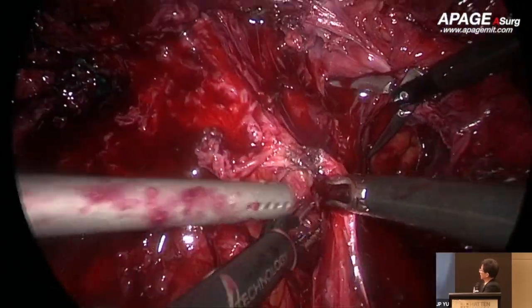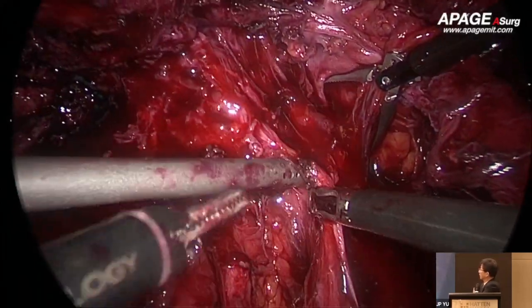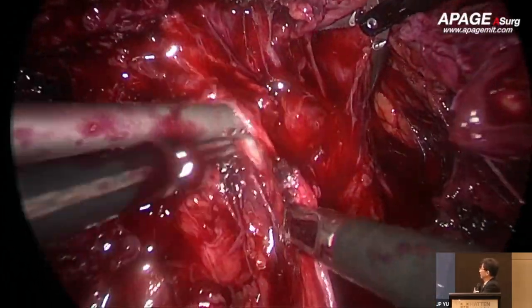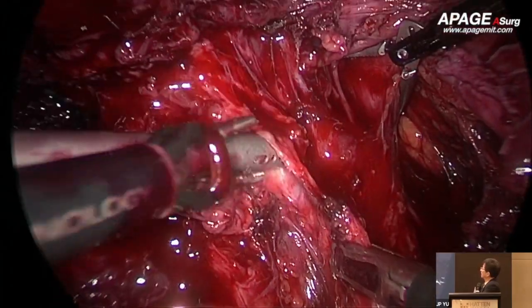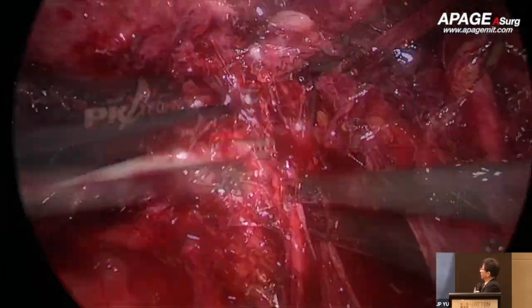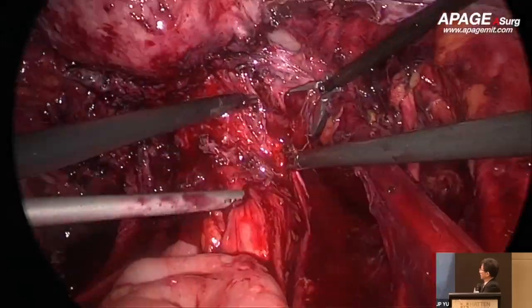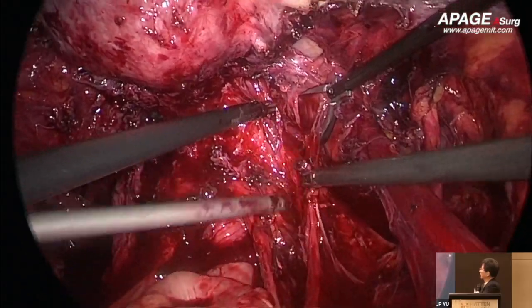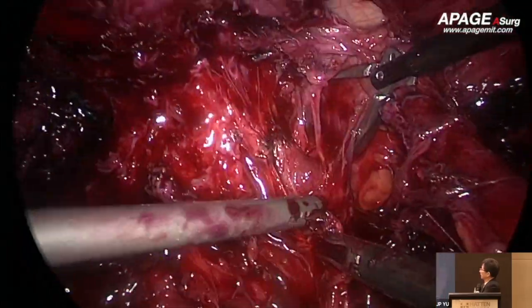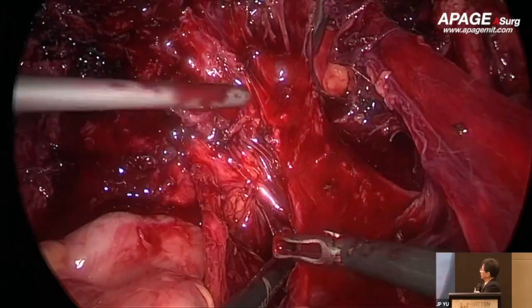You can find there is still a little oozing, but total blood loss was less than 300 ml after the surgery. Because of the inflammatory change, there is some bleeding over the rough surface, but there is still good hemostasis afterward. You can find the stricture of the rectum here because of the endometriosis. So we push down the rectum and create the prerectal space. Later on, we will resect the endometriosis lesion here.